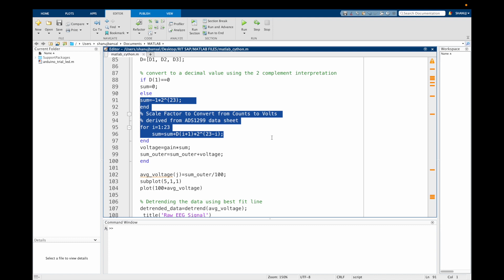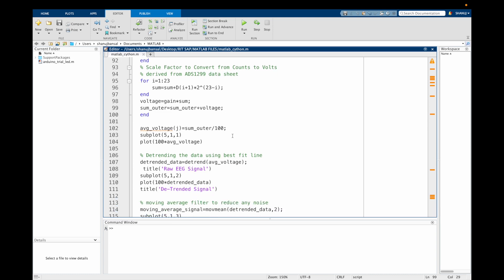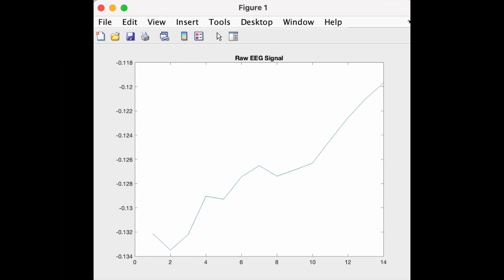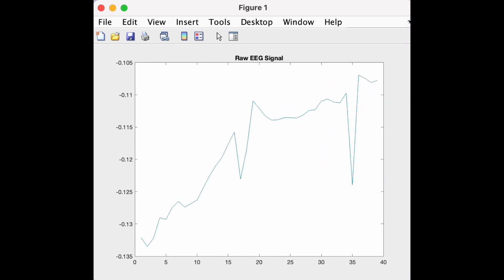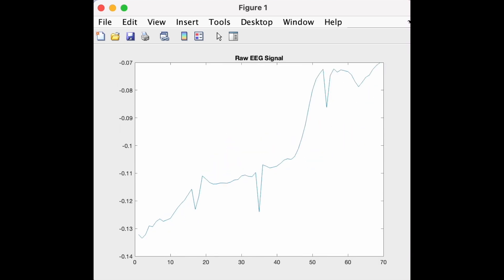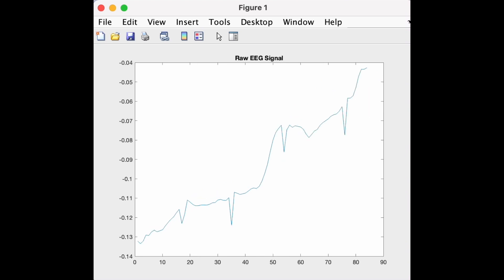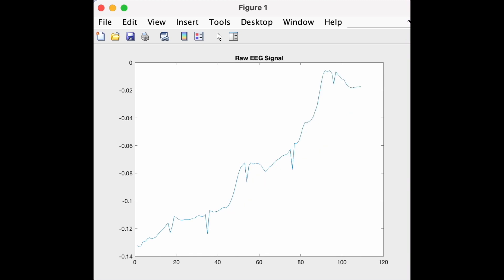This equation is derived using the ADS1299 datasheet. At the end, we simply use the command voltage equal to gain times sum, and sum_outer equal to sum_outer plus voltage. We now have the average voltage and can plot it. As you can see, we are able to read the data. The eye blinks are depicted by the voltage drops as we can see. Sometimes the data can keep going upwards or downwards — that is, the data might have a trend. This can be due to a number of reasons such as bad conductivity or something else.